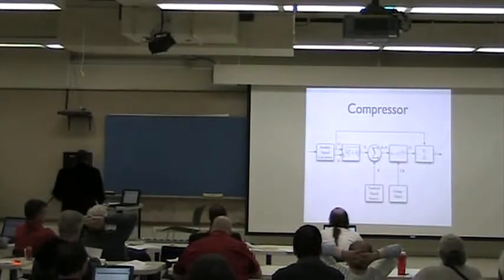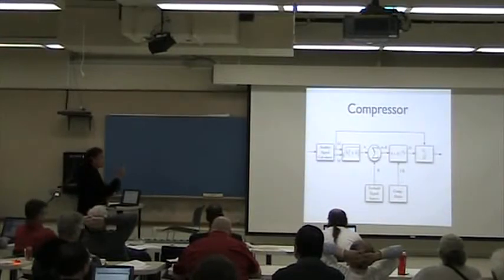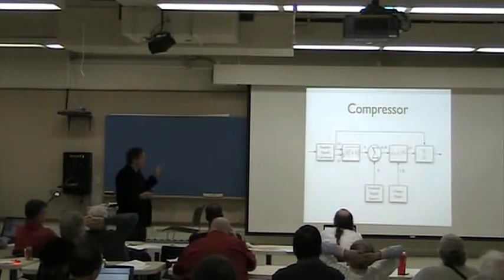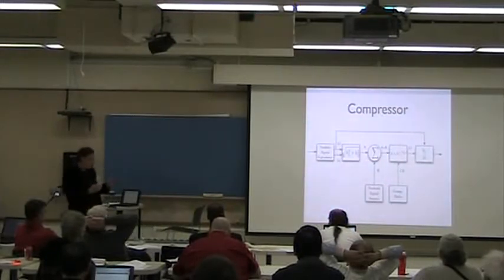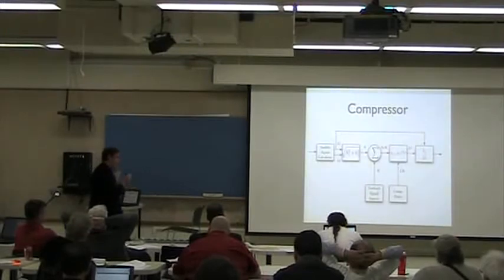The other important part of the algorithm is a compressor, and this is the way we're doing this compressor. The very important part of this compressing scheme is that it's instant. You don't need to accumulate a period or more than one period of the signal to figure out its envelope. We can figure out the magnitude of the signal with one sample delay.